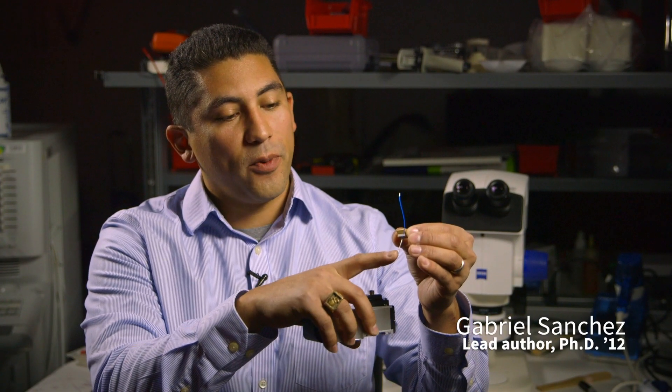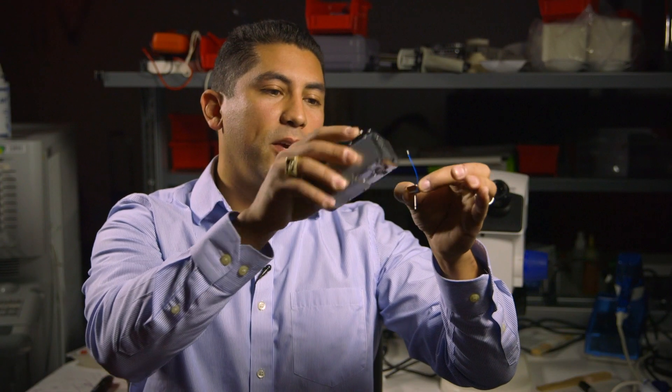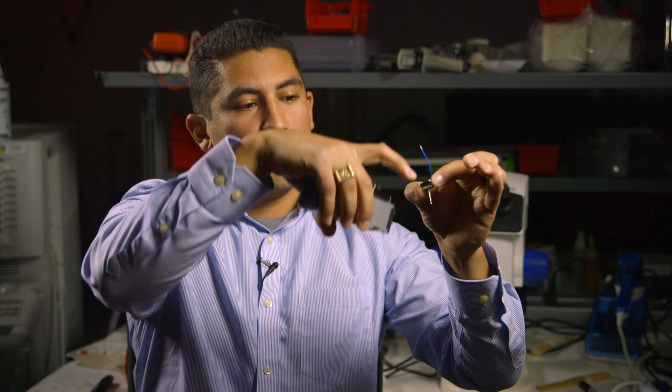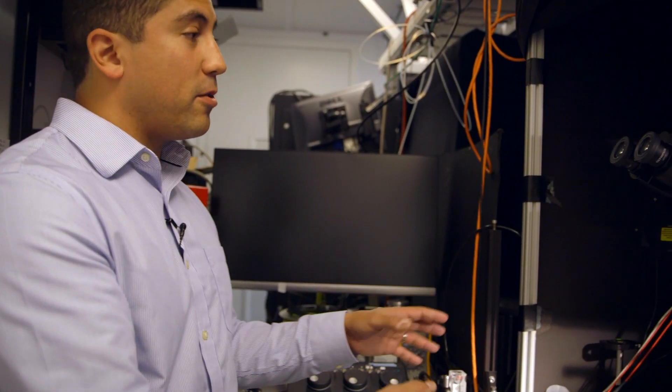This is the microendoscope needle — a 20 gauge needle with optics in it and a little window at the tip that we can stick directly into skeletal muscle. Because the needle is a conductor, we have a wire that we can send a shock through to elicit a contraction. This gets inserted directly into the muscle, and then this microscope attaches on top, delivering the light through the needle to excite the second harmonic generation to produce the image, then returning the light back up through the microscope to a fiber optic that goes to the cart.